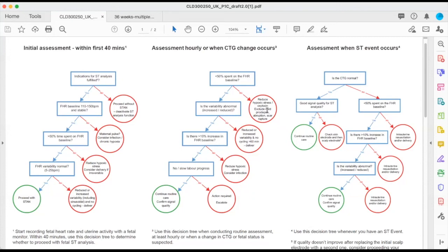You now have something that checks the baby's ECG to make sure that it is fine. How frequently do you need to make a check to make sure that this baby is not harmed? Frequently.